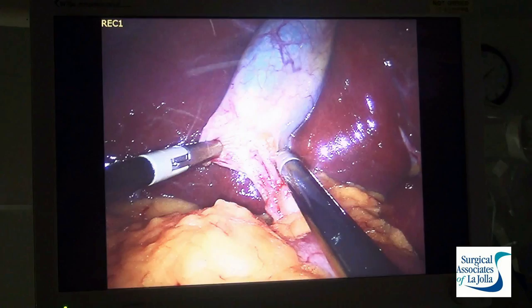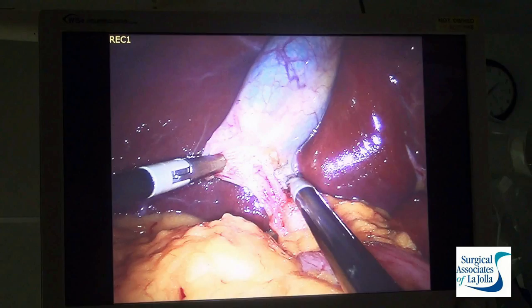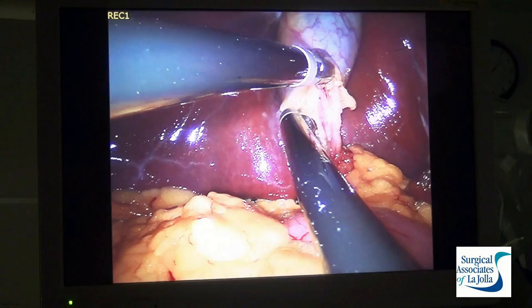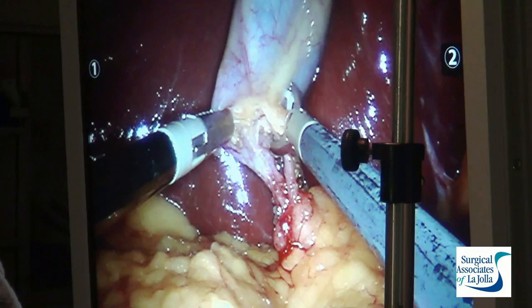Once we have the cystic duct and the cystic artery dissected free of each other and clearly visualized, we clip each structure so that we can divide them with no bleeding and no spillage of bile. Sometimes we do what's called a cholangiogram where we stick a catheter in and take an x-ray, but in this case we've simply isolated each structure, clipped them, divided with scissors, and then begin the dissection onto the liver bed.